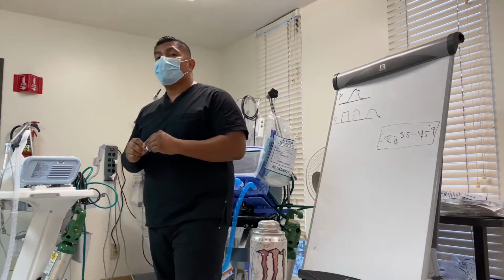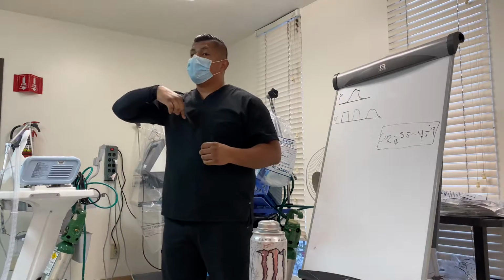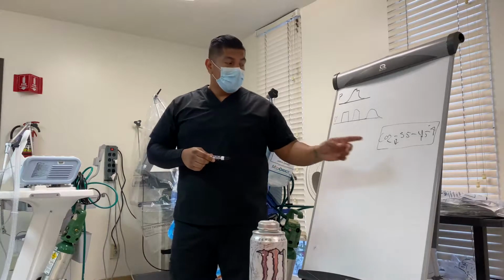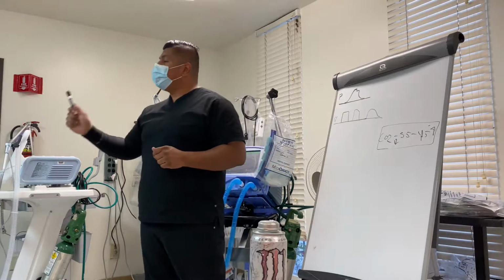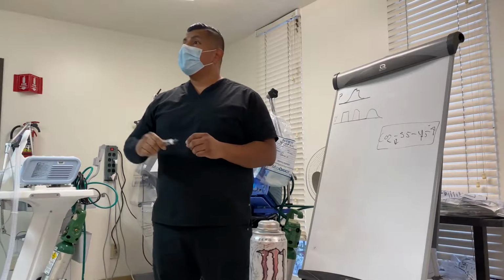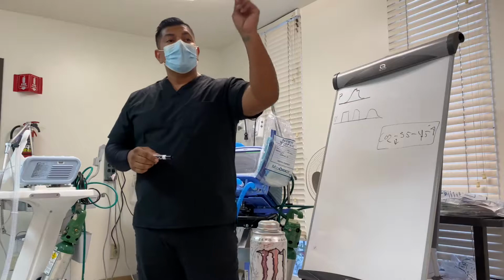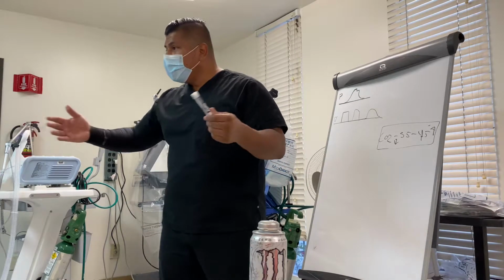Apart from the patient's altered level of consciousness, where we might have to insert an advanced airway to help them protect their own airway. Now, what is the most common mode that is used by the doctors today? Volume. Why? Why is it easy for doctors to say, you know what, put them on tidal volume 500? Ever think about that?